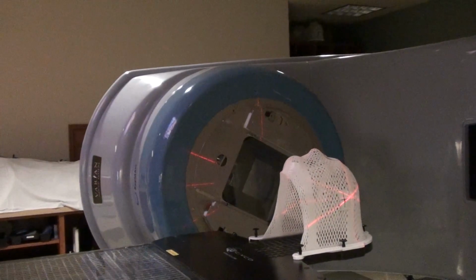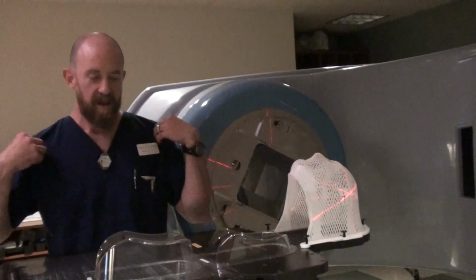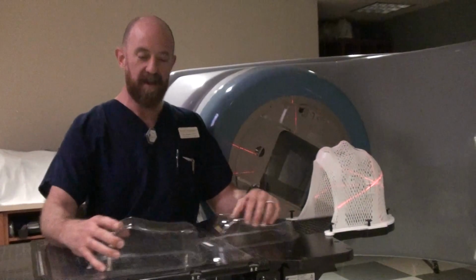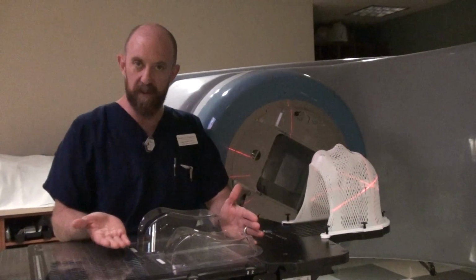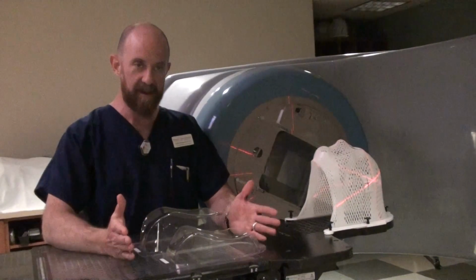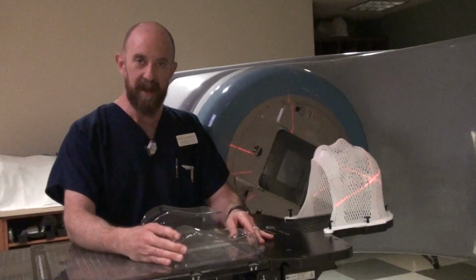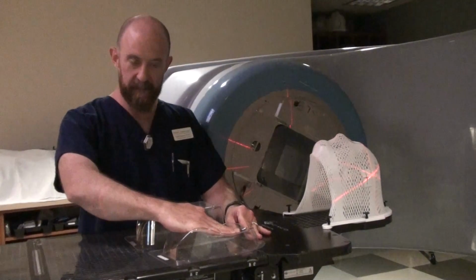Your typical headrest, if you're using the Timo Silverman headrest, is going to be a B headrest or an F headrest. These are basically exactly the same headrest. They're the same shape. The B just happens to be a little taller in order to accommodate someone who can't get their head back as far as a typical person would. You'll see these used about half and half. Normally, I see a B headrest as your most common. It puts the patient in a neutral position.